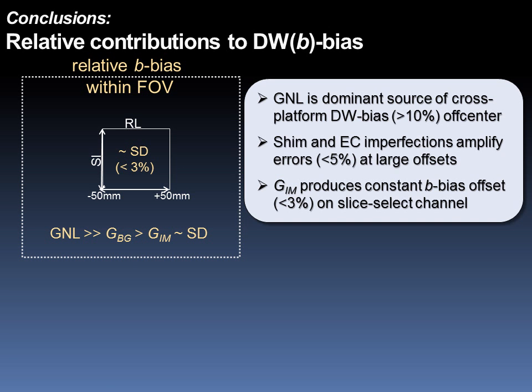In summary, the implemented protocol allowed empiric description of DW bias for individual gradient channels, regardless of vendor platform, and determination of the dominant sources of ADC error for multi-center trials.